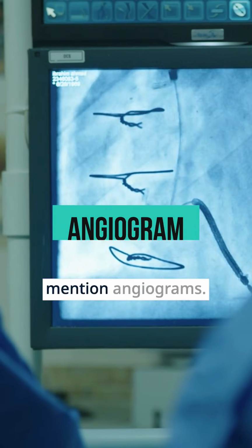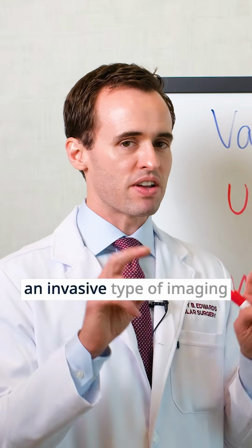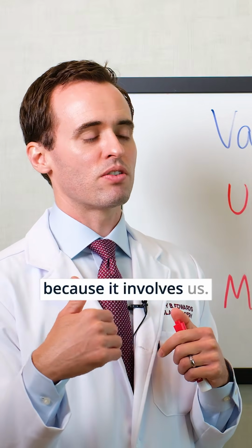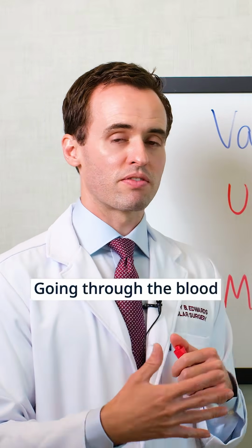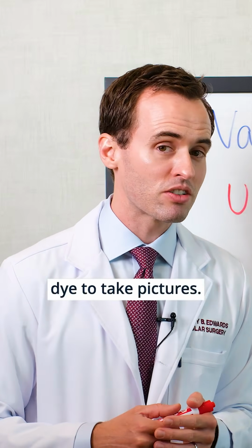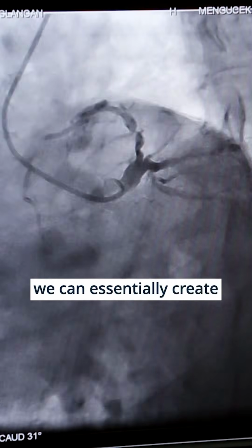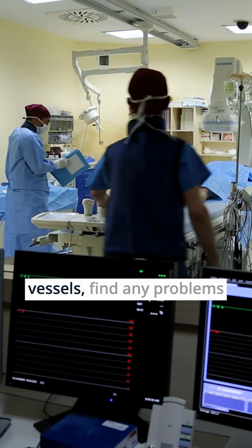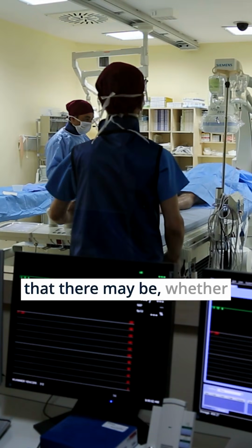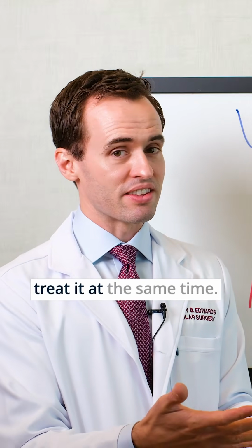And then I want to mention angiograms. So angiograms is considered an invasive type of imaging because it involves us going through the blood vessels, placing little catheters in the blood vessels, and injecting dye to take pictures. But by doing angiograms, we can essentially create a roadmap of all your vessels, find any problems that there may be, whether that's a stenosis or an aneurysm, and we can treat it at the same time.